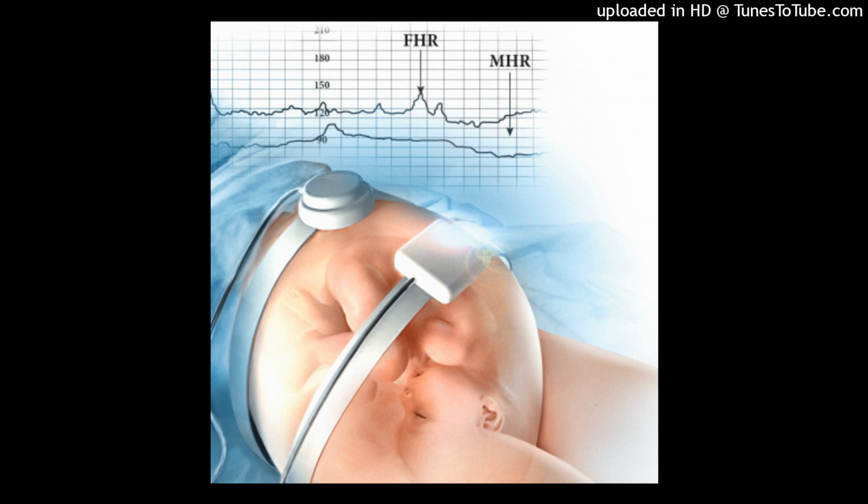This device may provide additional information compared with intermittent auscultation, IA, in identifying fetuses at risk for hypoxic injury that may result in permanent neurologic injury or death. Each method of fetal surveillance has advantages and limitations. Both approaches can be interchanged depending on pregnancy risk factors, current clinical situation, patient's preference, nurse-to-patient ratio, and institutional policy. When necessary, timely and appropriate corrective measures can be taken to improve fetal oxygenation and avoid unnecessary interventions.